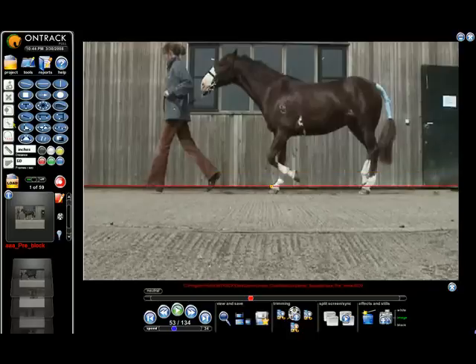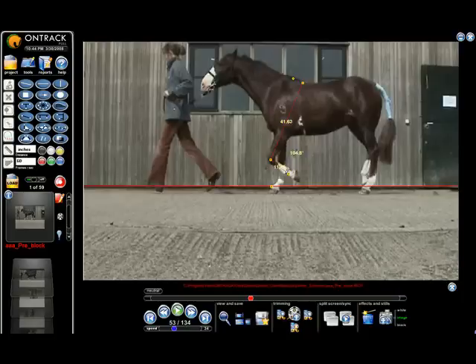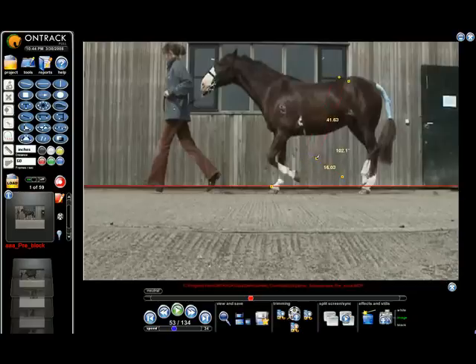Angles work the same. You just click on the point you want to start with, come up and grab this, hold, and you can move these toggles around to whatever position you want. On the angle tool, if you hold down the control button and then grab a toggle, you can move that angle and keep the shape.